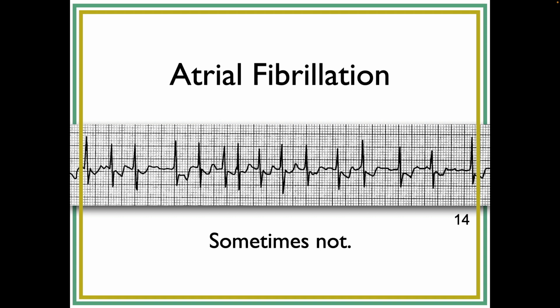The longer that somebody is in AFib, it tends to remodel the atria, and one of the results of that, and I'm not sure why, is that the longer somebody's in AFib, the fib waves get smaller and smaller and smaller. Okay, so it's very possible to see somebody in AFib with a perfectly flat isoelectric line. So you have to depend on irregular, and no P waves.